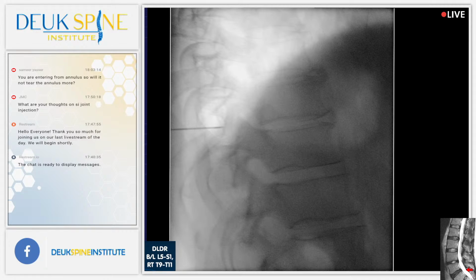Oh, it's really fascinating on that view right there. You guys see the view there? It's really cool. Ray of sunshine. No, look at the front. See, this is the telltale sign. I've seen it before. Look at the front of 10, 11, and 9, 10. Look at the bone spur there. All the other discs don't have that. That tells you these are damaged discs. We struggled so hard to find them. All right, lateral.